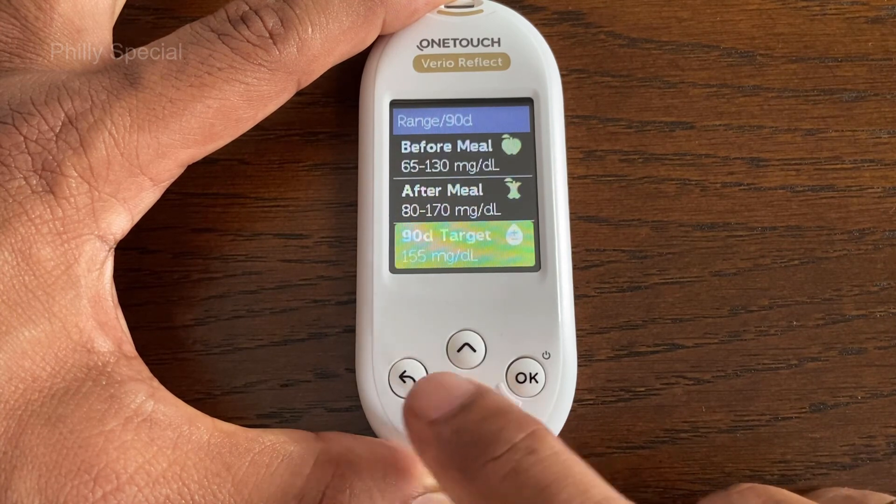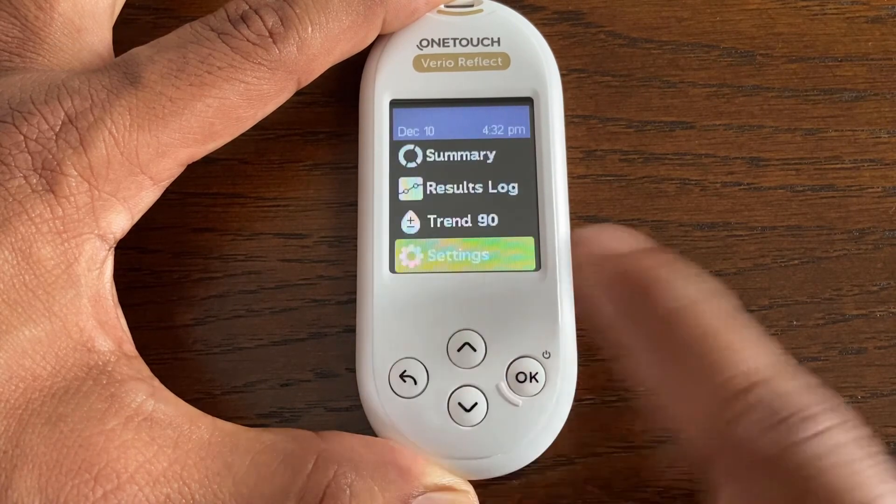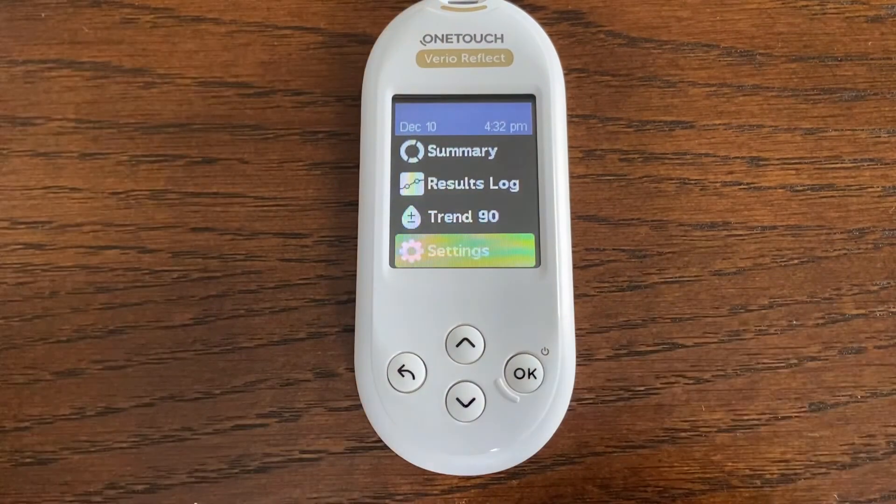Once all changes are made, press the Back button to return to the main menu. This is how you can change the range limits on the OneTouch Vario Reflect meter. Thank you so much.